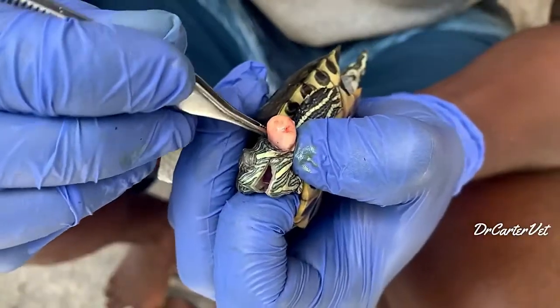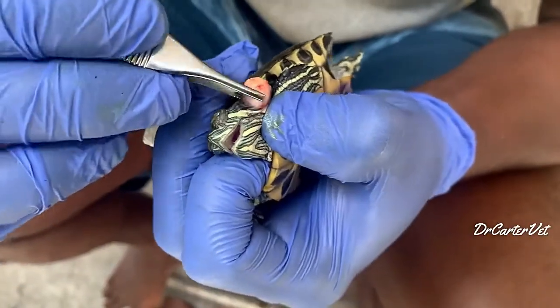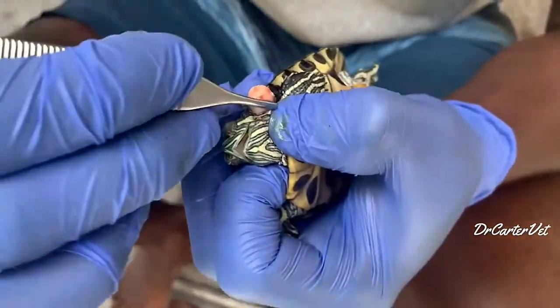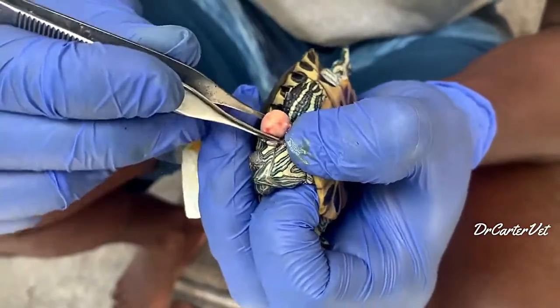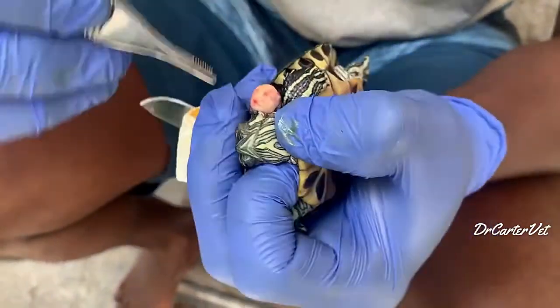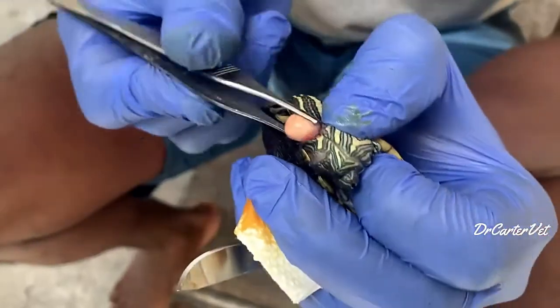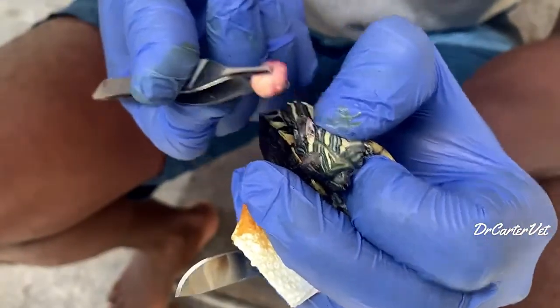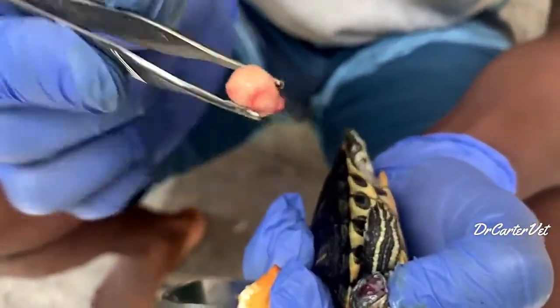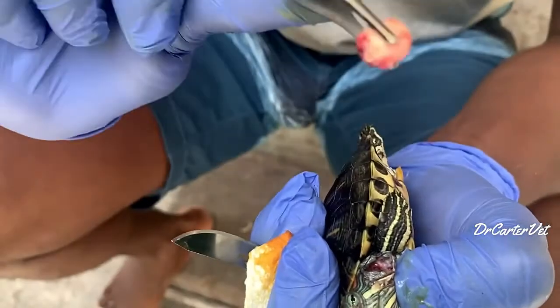Now, the middle ear — or the internal ear — goes deep. This can affect not just balance in a walking animal, but in this turtle it affected the animal's growth. It couldn't feed as it wanted to and didn't grow right. So you can see here, I just screwed it off a little bit.